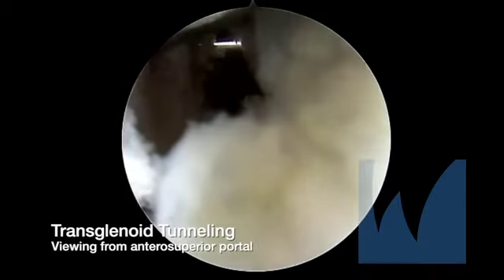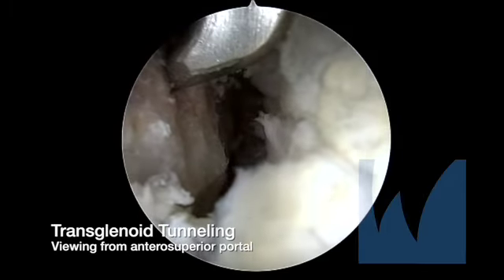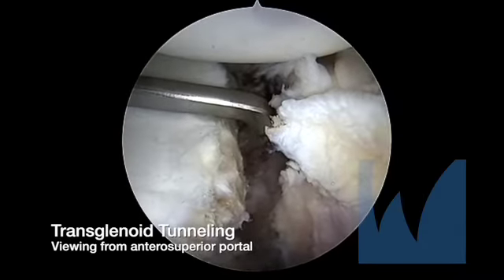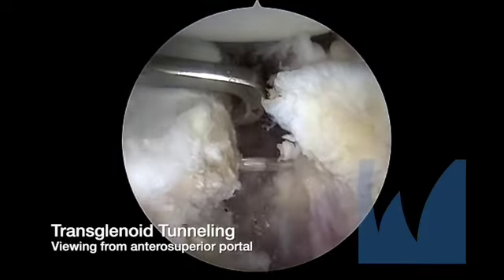A double glenoid drill guide is aligned perpendicularly to the glenoid rim at the level of the midpoint marking and used to create inferior and superior transglenoid tunnels. The drill is advanced so that the edge of the sleeve aligns with the anterior edge of the glenoid.